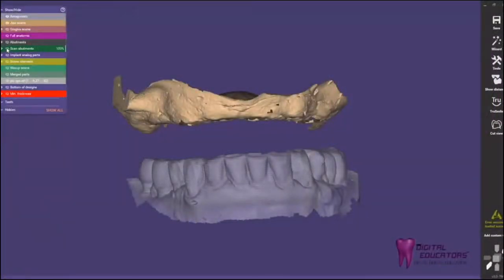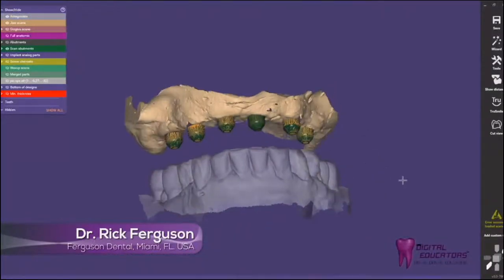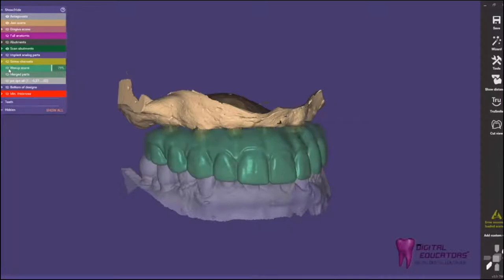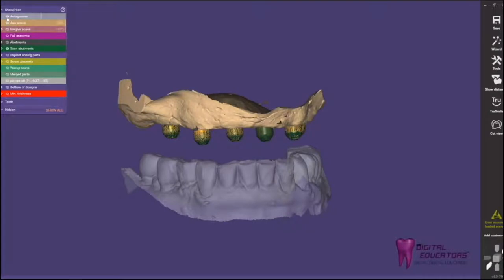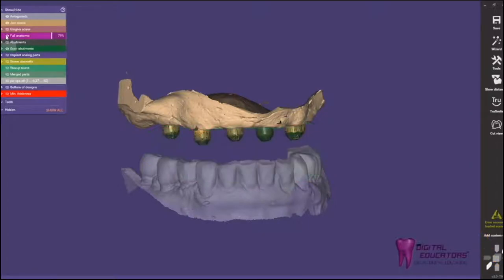Testing 3D printers for accuracy, I use a standard temporary hybrid that I have designed using Exocad. So in this case, we're designing a hybrid using a stone model that was produced from a standard open tray impression technique. And the scan bodies are actually the cover caps for the multi-unit abutments. So we scan the multi-unit abutments and then design the temporary hybrid in Exocad, and then we can export that file and print it on a 3D printer. And in this particular case, we are designing it so that it goes directly to the multi-unit abutments, which eliminates the intermediary tie bases.